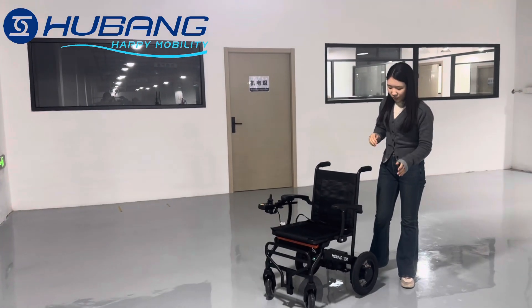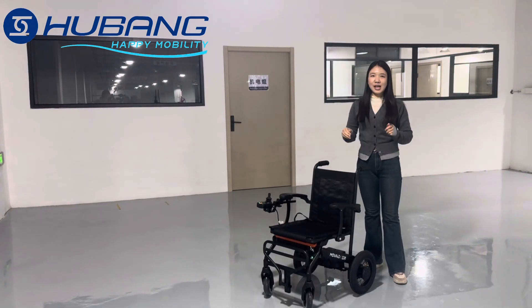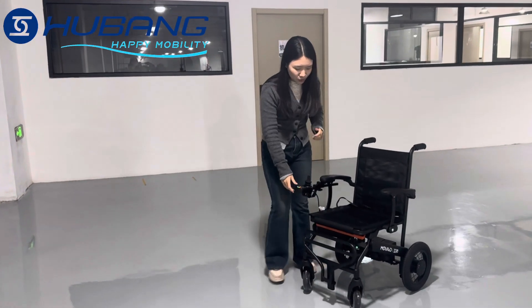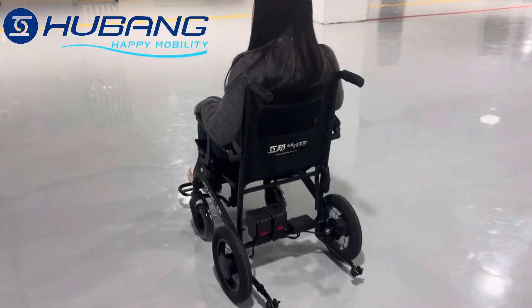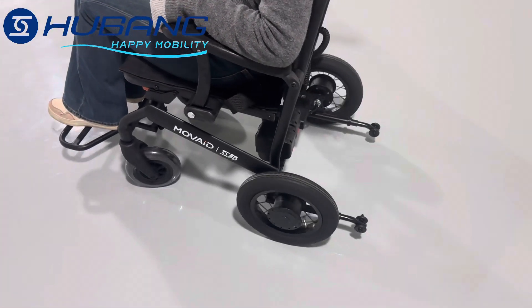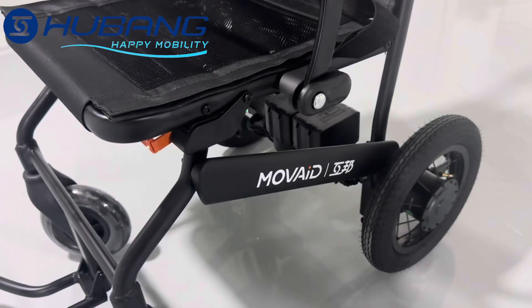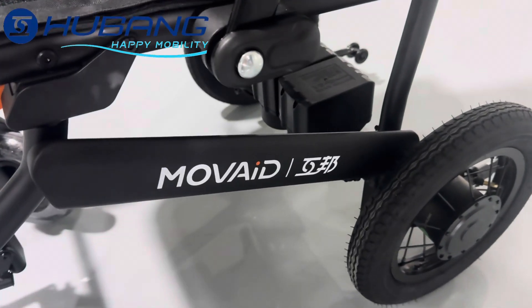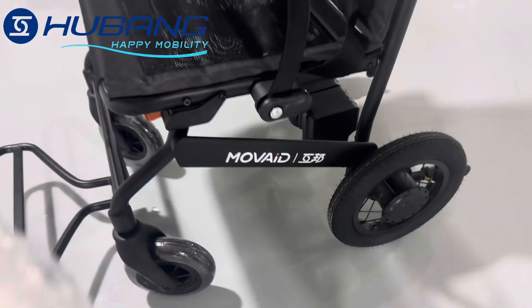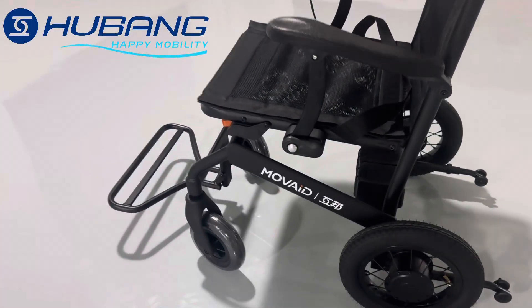Firstly, it is equipped with a high performance Japanese technology motor with 300W power on each side. You will feel a big difference when you are on the uphill — it is more powerful than the normal one. Plus, it is quieter than ever. Even when you are in a quiet public place such as a library, there is no need to worry about the sound of the motor affecting others. It is just smooth and peaceful travel.